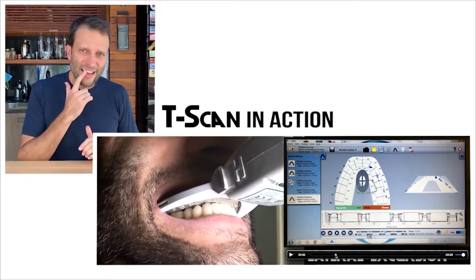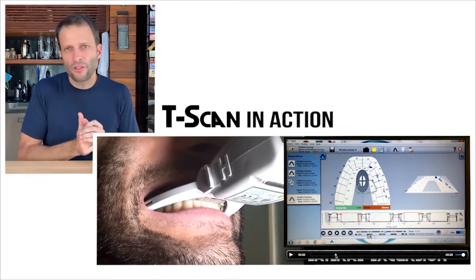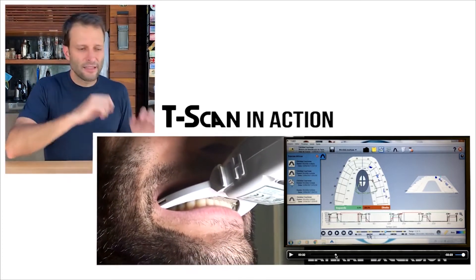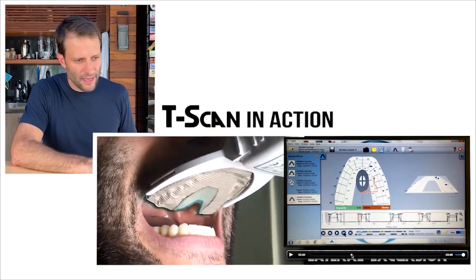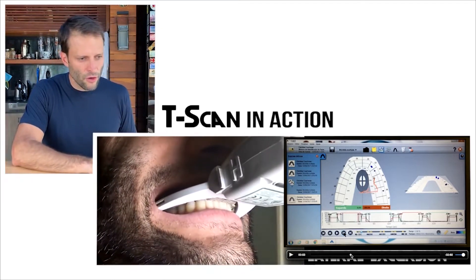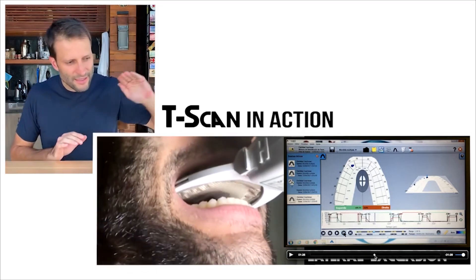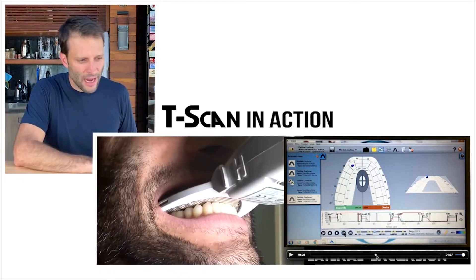Imagine that I'm placing an implant crown on my lateral, and as I cement or screw the crown, I do the T-scan. I can identify that as the patient is sliding to the right, almost the whole load is exactly on that lateral implant — very useful information. I'm biting again and sliding again, and you can see very little contact on the canine and a lot of load on my lateral. On my left side, the same thing — I have almost only guidance on my left lateral as well. So right side and left side, both only lateral guidance — very interesting information.